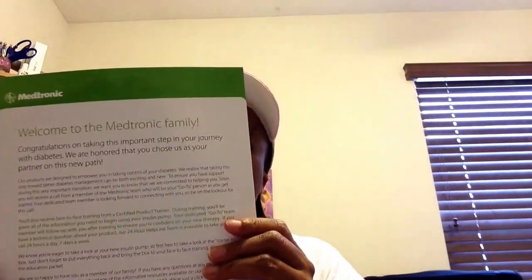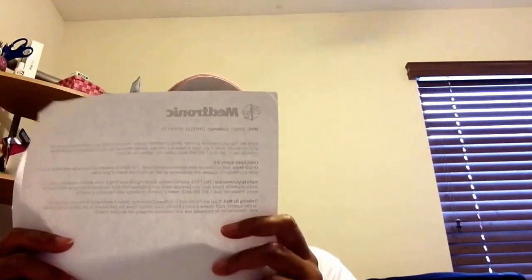A really nice personalized welcome paper came with it, signed by the director of customer experiences, which is nice. I also received paperwork that showed exactly what was included with the starter kit, and an important information sheet pertaining to the use of the Paradigm Infusion Sets — that's a user guide showing you how to use them. The second box also had paperwork with my personal information on it.